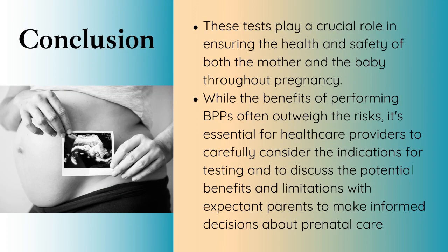These tests play a crucial role in ensuring the health and safety of both the mother and the baby throughout the pregnancy. While the benefits of performing BPPs often outweigh the risks, it's essential for healthcare providers to carefully consider the indications for testing and to discuss the potential benefits and limitations with expectant parents to make informed decisions about prenatal care.